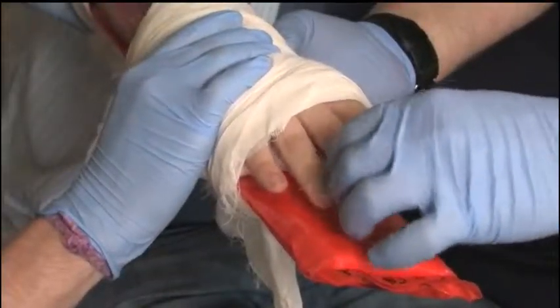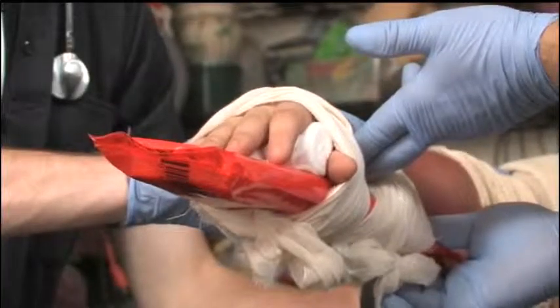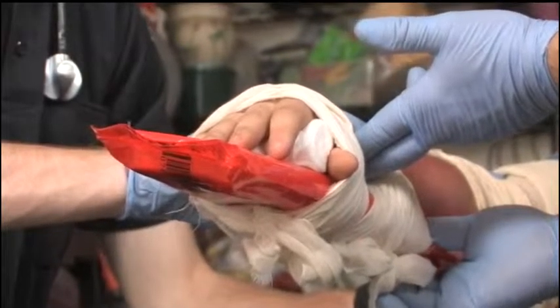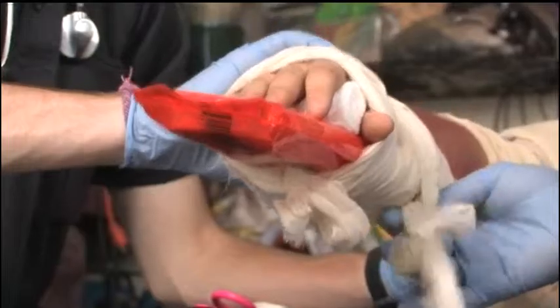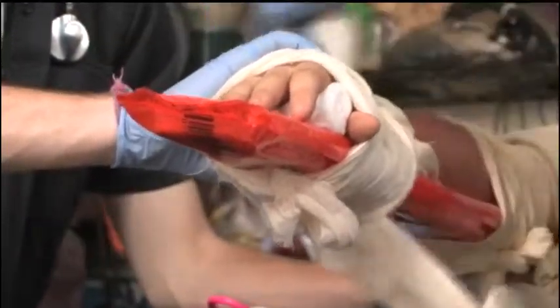Recheck distal PMS now and periodically throughout the treatment and transport to ensure the splint was not applied too tightly or that swelling of the extremity is not creating a new situation where the splint is now too tight. If the splint is applied too tightly, loosen it immediately and reassess distal PMS.